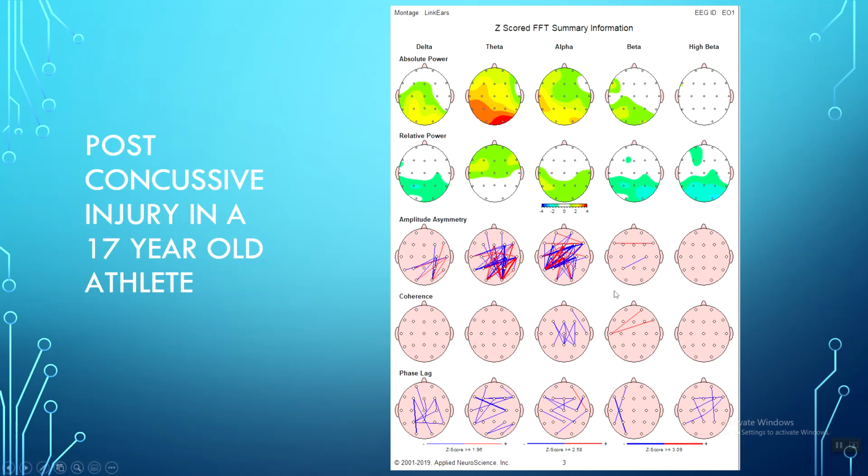The exception is if the person is taking medication or not, this would be different. The medication that is the most impactful with the EEG is a GABAergic medication, which is things like a benzodiazepine, medications that are going to enhance the amount of inhibitory neurotransmitters. And you will see a shift in the EEG. It will start to produce more high amplitude beta 2 and beta 1, even into beta 3. But generally beta 1 and 2.